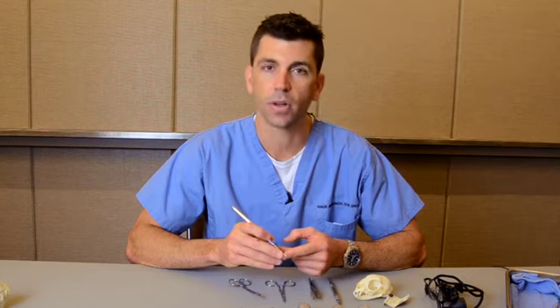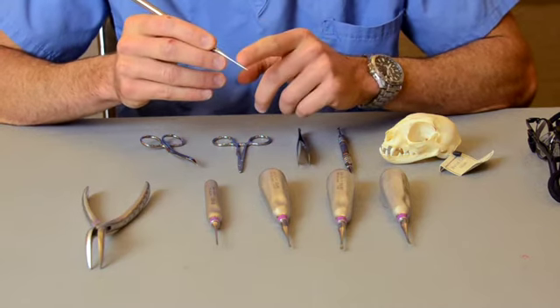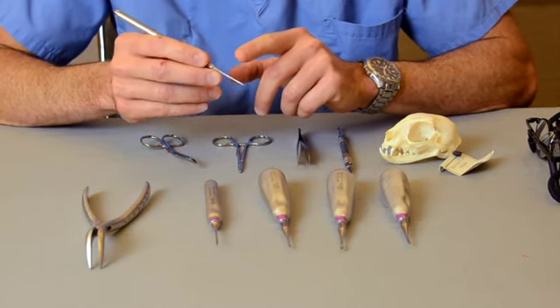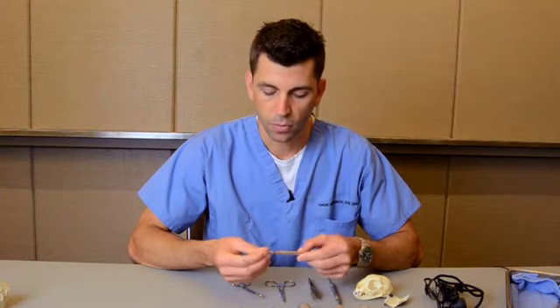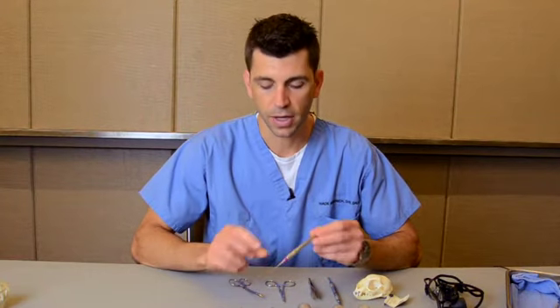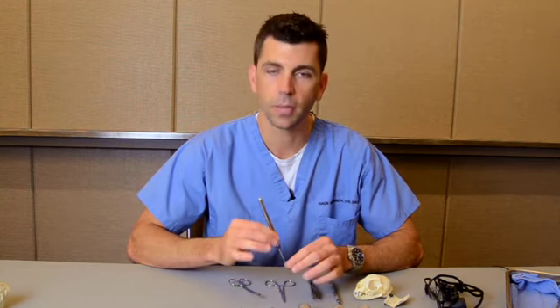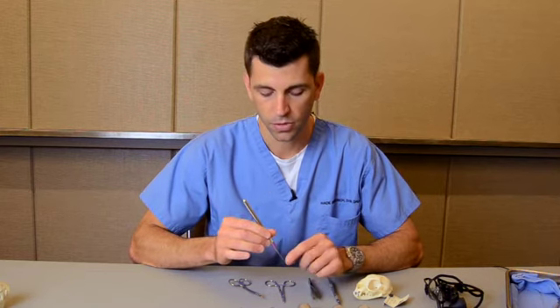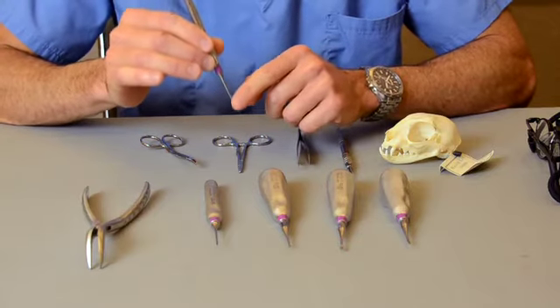Because that's when we run into a lot of complications, is forcing an elevator or a sharp instrument such as this into the mandibular canal, the nasal cavity, or even worse, potentially the eyeball. So when using a root tip pick, it's important to not apply force forward, but to only work this into the periodontal ligament space 360 degrees around the root, trying to slowly weaken that periodontal ligament around the root tip, but without applying a lot of force apically.